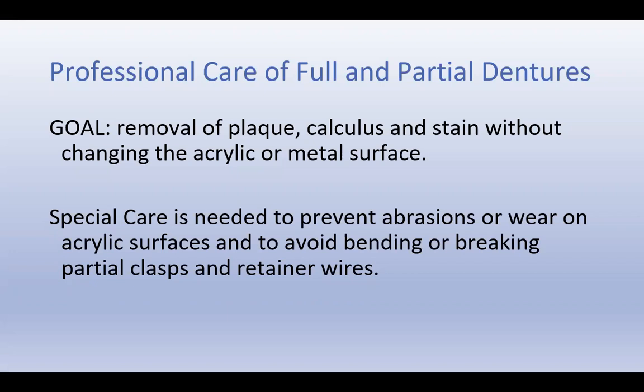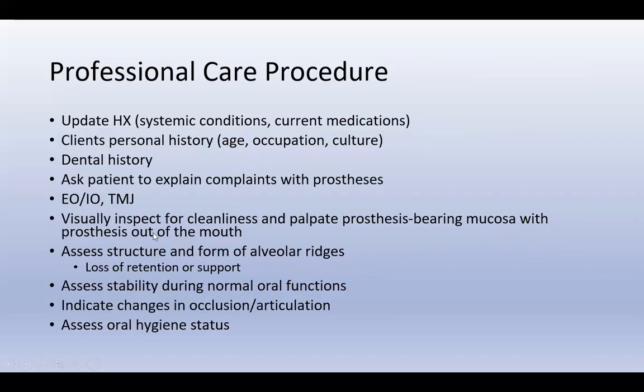I have taken a scaler and an ultrasonic to a denture before. I've done it many, many times, and you just do it very mindfully. Don't use the tip, don't gouge it. You don't want to gouge or poke at the acrylic or scratch up the metal and make it rough. Use a very light touch, and usually what's built up on there comes off very quickly. Special care is needed to prevent abrasion or wear on acrylic surfaces and to avoid bending or breaking the partial clasps, those metal clasps, or the retainer wires.